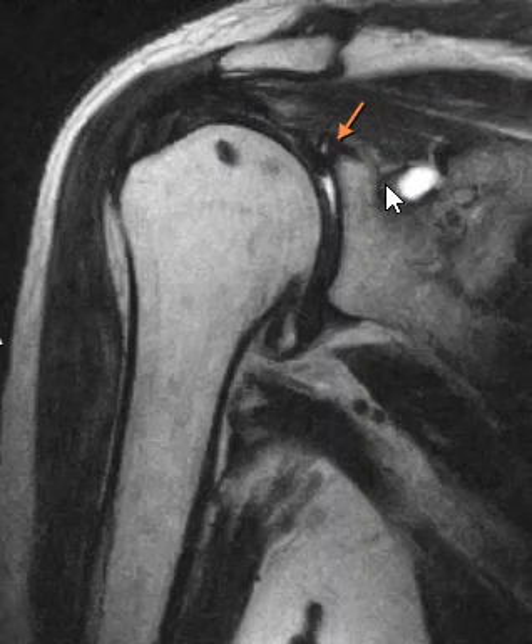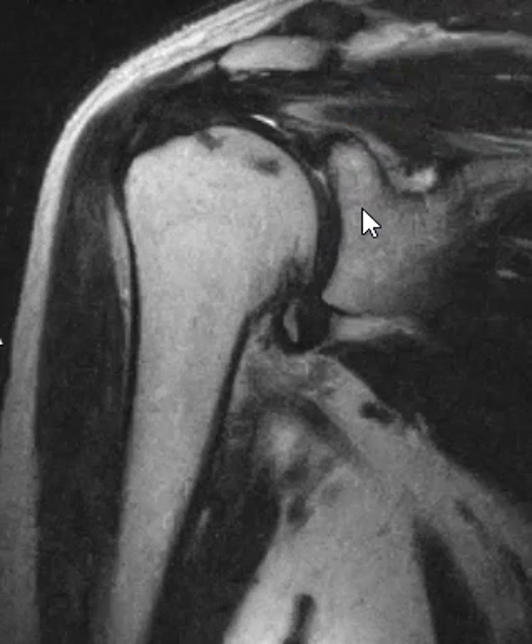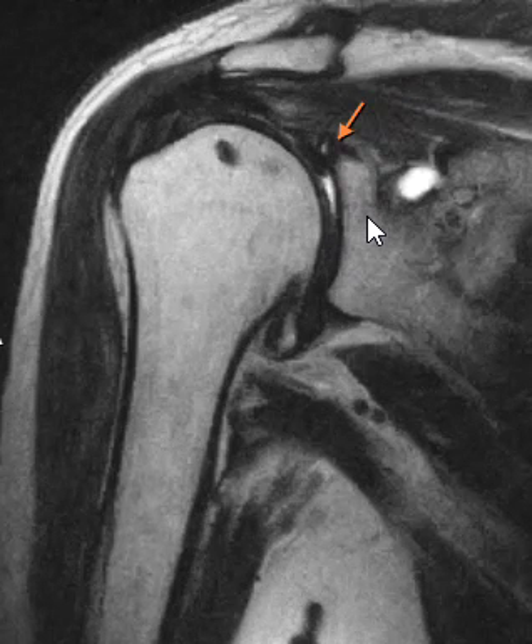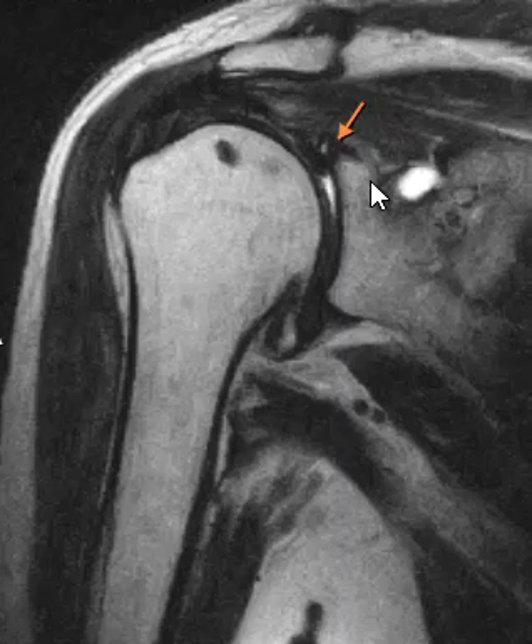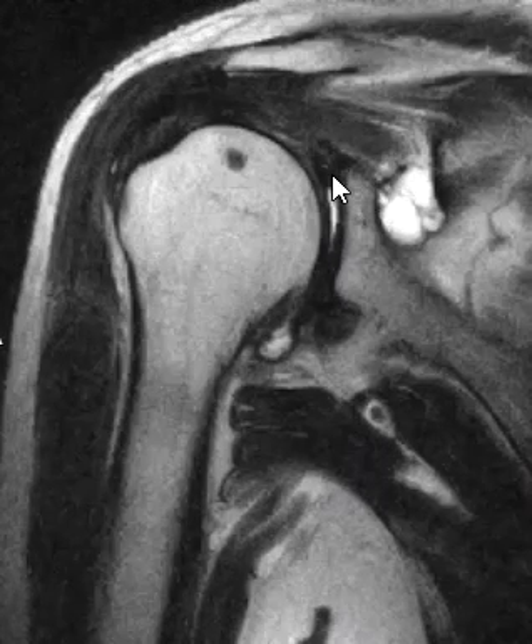I have an arrow here on a labral tear — they had to repair the labrum, but there's a new tear here. It doesn't show up that well on this view, but you can see right there a little bright dot. If we go towards the back, this is about the 12 o'clock position, and we can see a little bit of grayness there — so there's a tear of the posterior superior labrum.